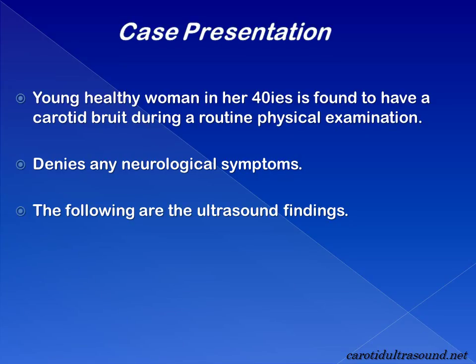So our patient of today is a young healthy woman in her 40s. She's found to have a carotid bruit on a routine physical examination. She denies any neurological symptoms, and here are the ultrasound findings.